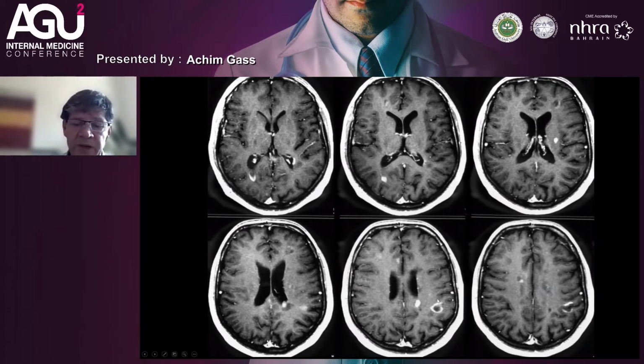And such contrast enhancing lesions can have very different phenotypical features. They can be solid, punctate, juxtacortical. They can have contrast enhancement right at the periphery, or as you see on the next slide, right next to the cortex. But what they have all in common is that the contrast between the normal tissue and the lesion is very clear. So it's very useful if you want to see how active a disease is, particularly in the situation of the early diagnosis, or when patients have many T2 lesions and it's hard to detect a new T2 lesion, but contrast enhanced imaging will help you.